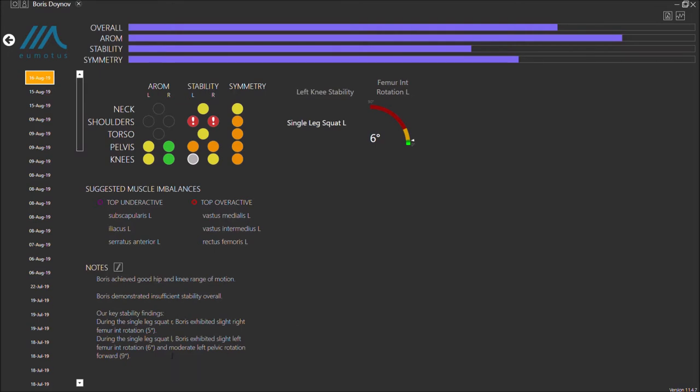In this case, we know that while Boris had good range of motion, the stability was somewhat lacking, including some potentially worrisome internal femoral rotation or knee valgus, as well as some pelvic rotation forward on the left side.